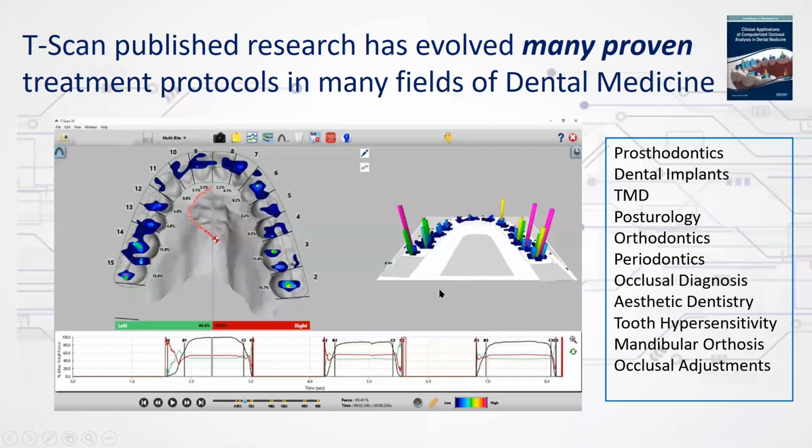And that is a really important thing I want you to understand. If you don't have a matched arch, you're going to be basically trying to figure out, what cusp is this contact on? And the T-scan software itself, or merged with an STL file, completely eliminates that issue.